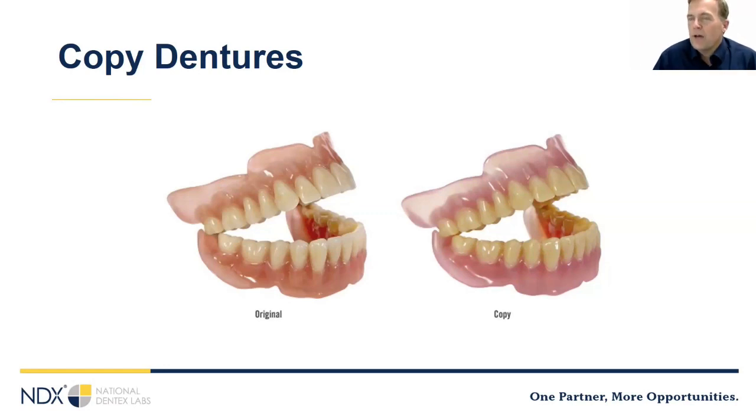Most laboratory software does not have the equivalent of CEREC biocopy, where you push a button and it makes it exactly the same as the preoperative teeth. So it will require some skill from the designer, and there may be slight variations. But again, you remember the image that we saw of the purple bite block in the teeth. Your laboratory can superimpose their teeth on the previous prosthetic to make sure it's right. It's good to know it's available. It may not be something you do a lot of, but it's out there for what it's worth.